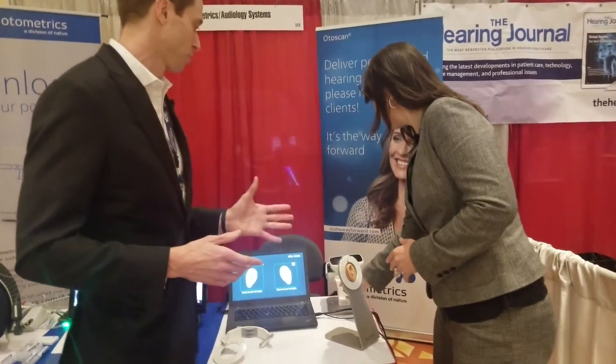In our trials, we've seen that instead of the average being about 18% on remakes, we're going down to 10% to 12%. So patients don't have to go back to the clinic for adjustments — that's another time saver. Fewer times back to the clinic saying it hurts their ear, or it's not fitting, or it's coming out. We're getting a higher success rate on the fit the first time. So that's enough talking about the benefits — let's actually look and see what it does.